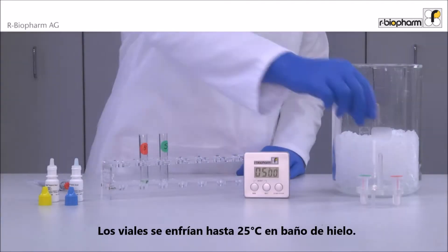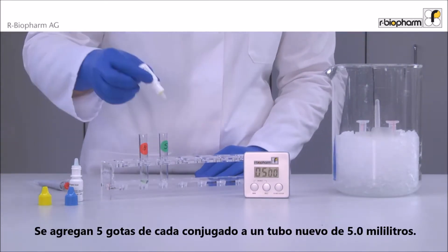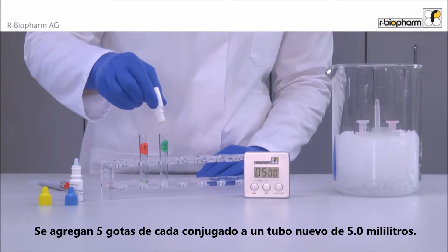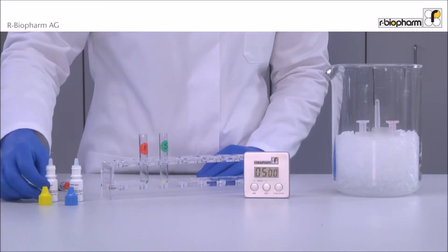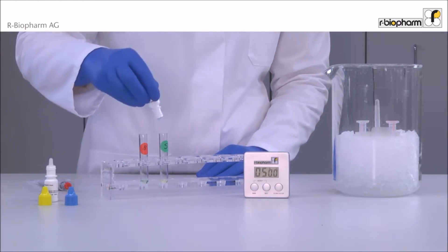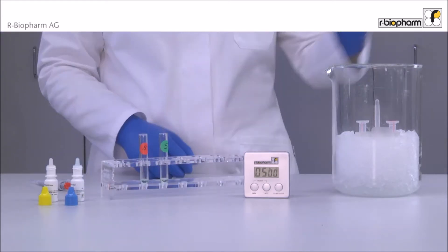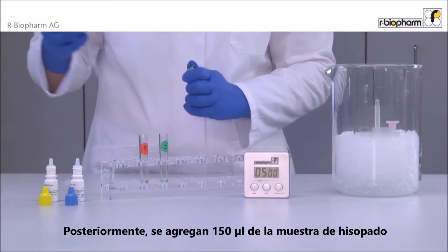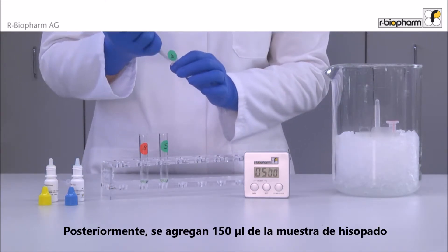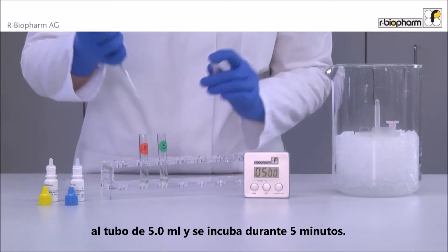The vials are cooled down to 25 degrees centigrade. Then five drops of each conjugate are added to new 5 milliliter tubes. Next, 150 microliters of the swab samples are pipetted to the 5 milliliter tubes and incubated for five minutes.